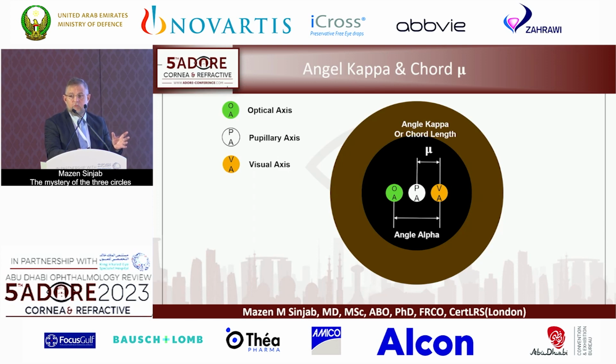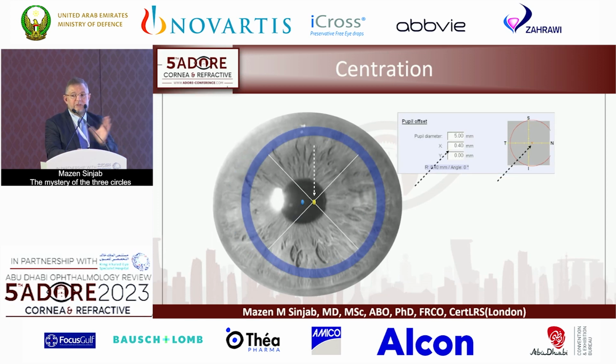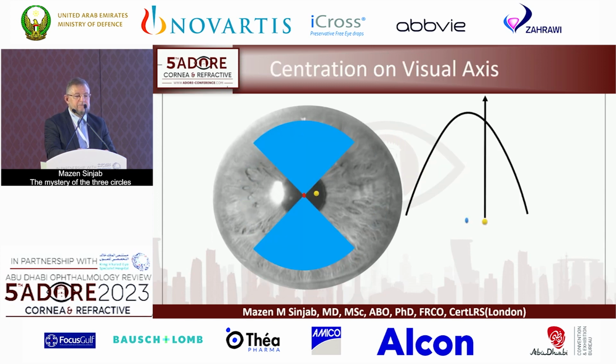But we have to decenter it. Usually we decenter the ablation treatment by either manual input or sometimes automatically transferred from the imaging system to the machine.